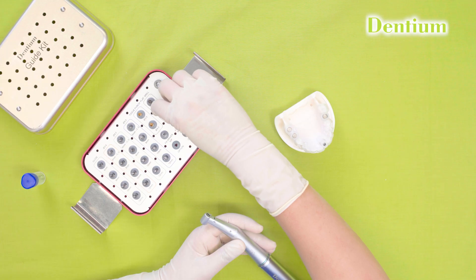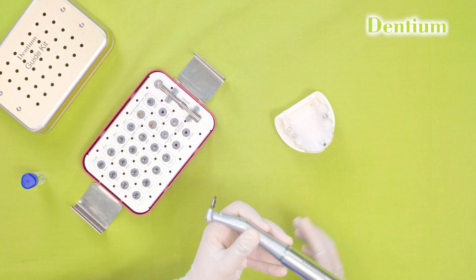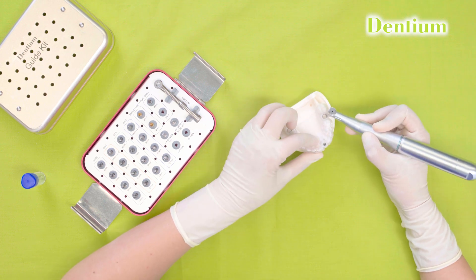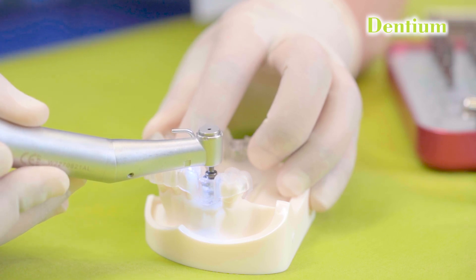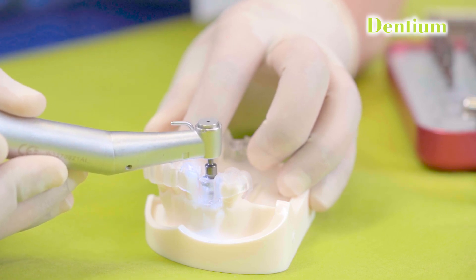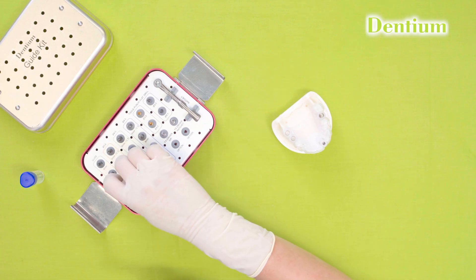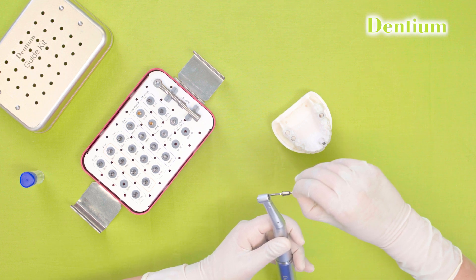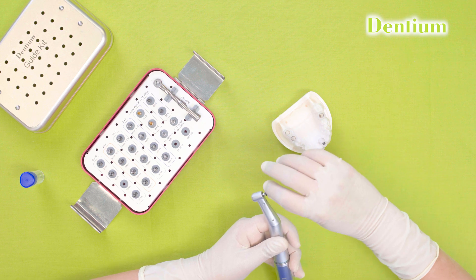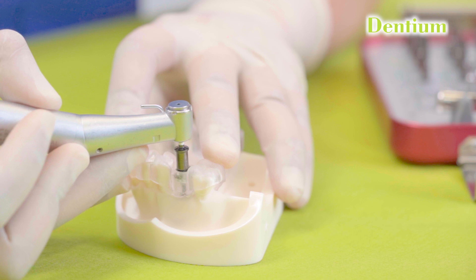To start the procedure, first I will be using the flat drill to smoothen the irregular surface of the bone. The speed to use the flat drill will be 1000 rpm. After flattening, I will be using a 10 mm guide drill. The offset of this drill is 9.3 mm — 4 mm of the offset will go inside the guide, whereas the 5.3 mm will be at the level of the gums.